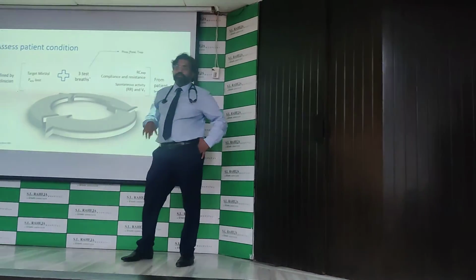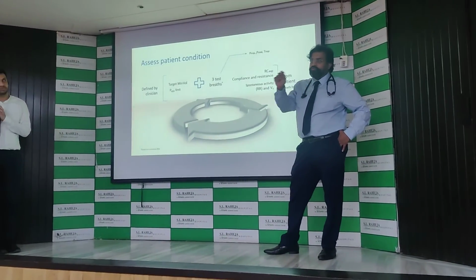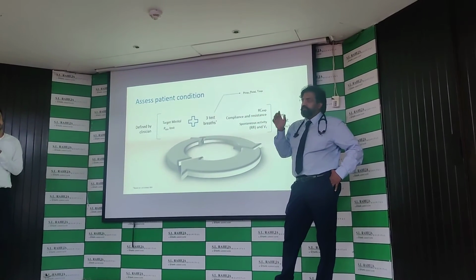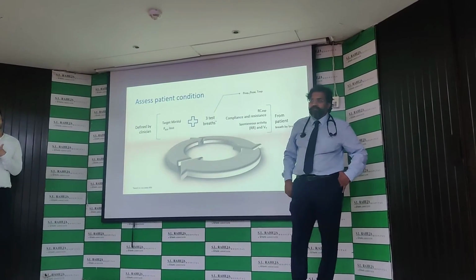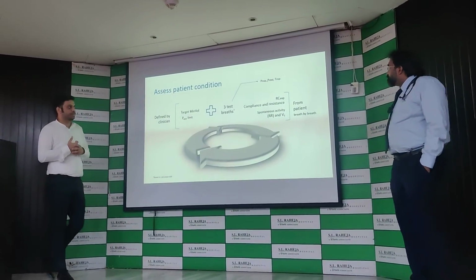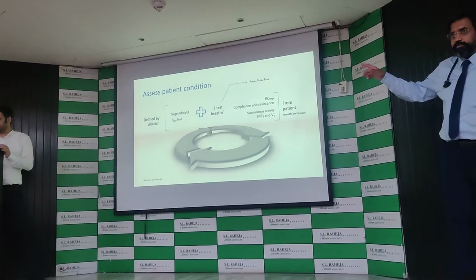So what we should do, on our existing ventilator, is change the ventilation and see whether it is actually giving those 3 breaths. If it is giving those 3 breaths, then we know that this is how it is working after every change of minute ventilation. Okay. So this is knowledge-based communication.